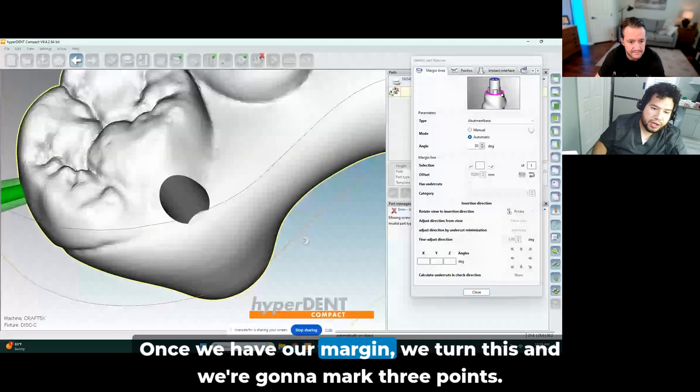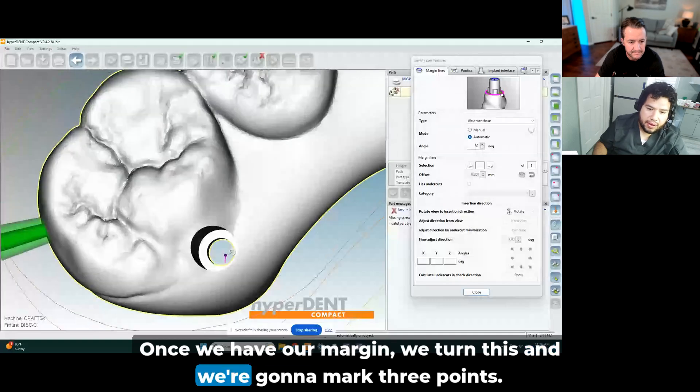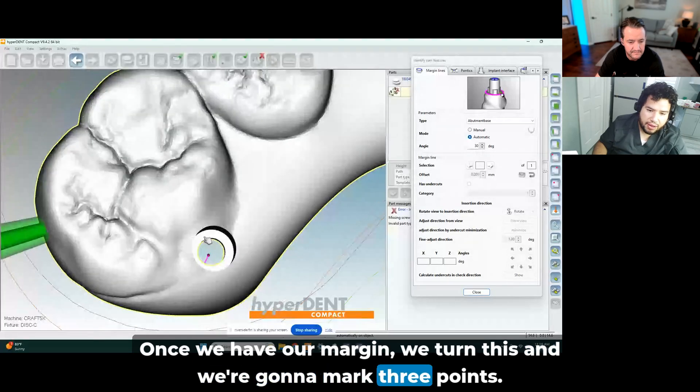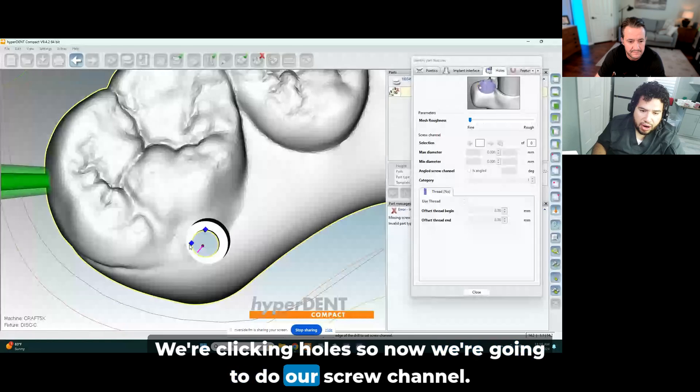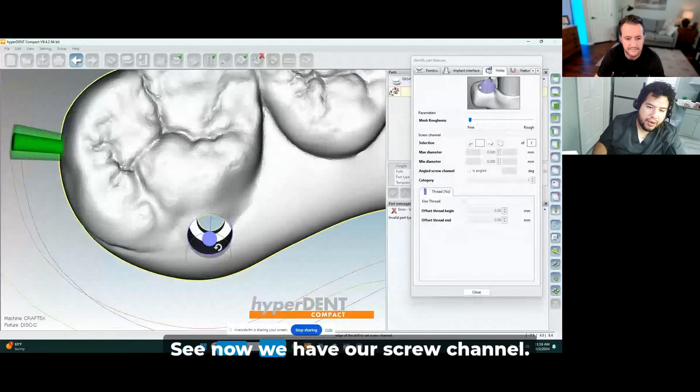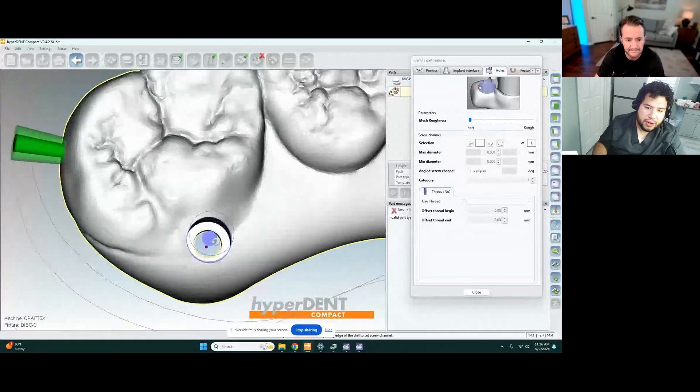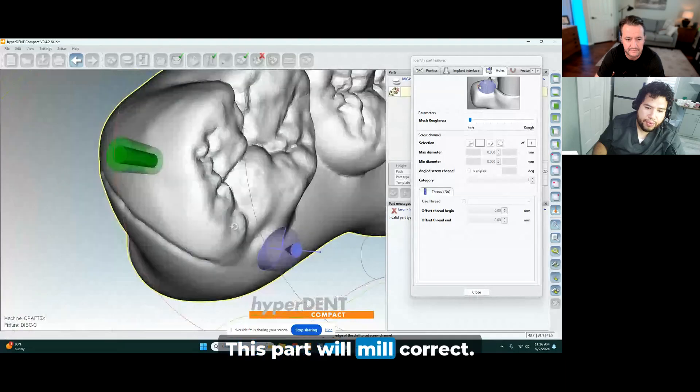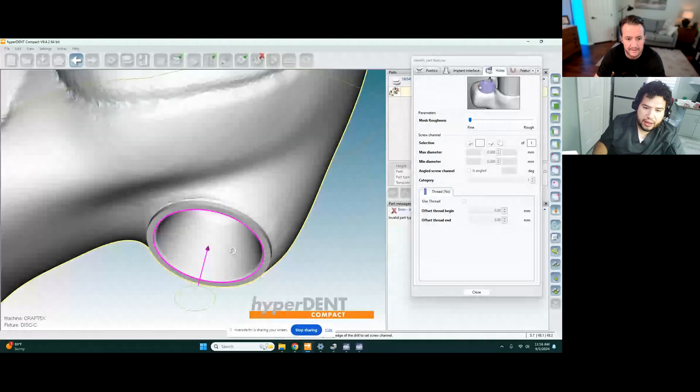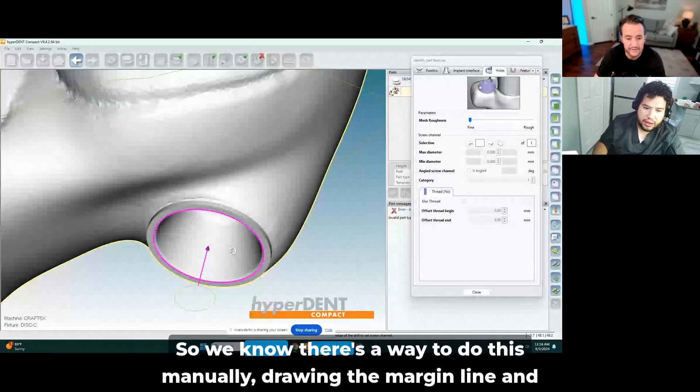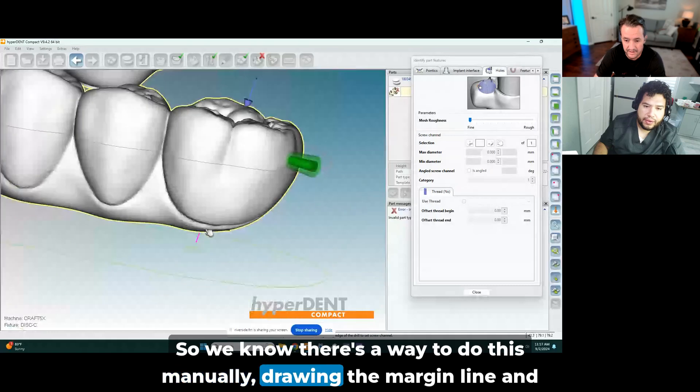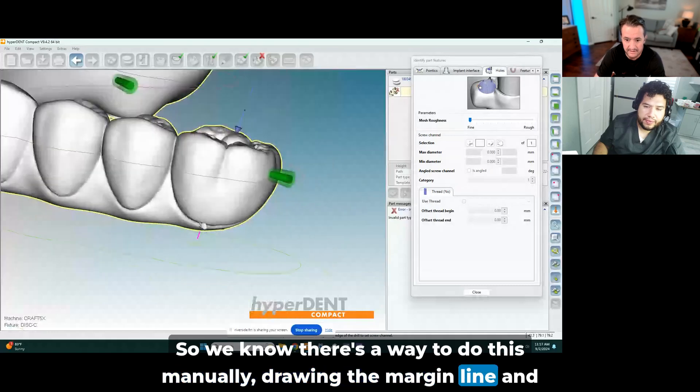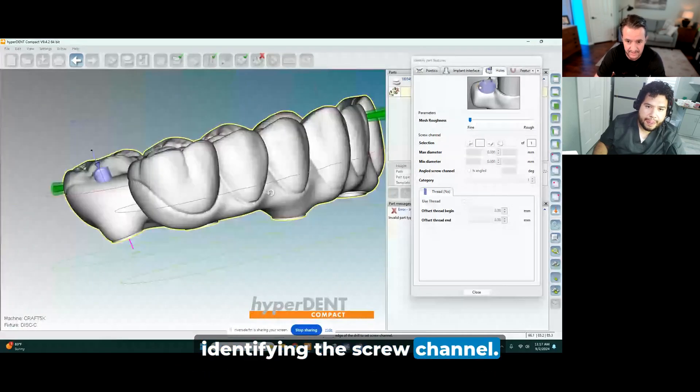Once we have our margin, we turn this and we're going to mark three points. We click on hold, so now we're going to do our screw channel. Now we have our screw channel. This part will mill correct, and now we have our margin line.